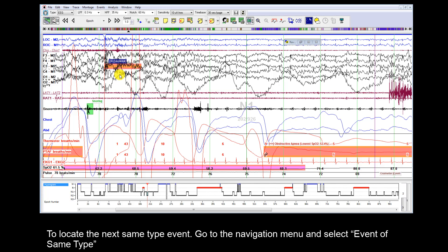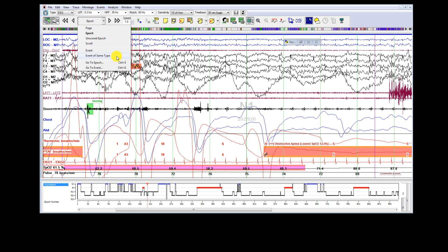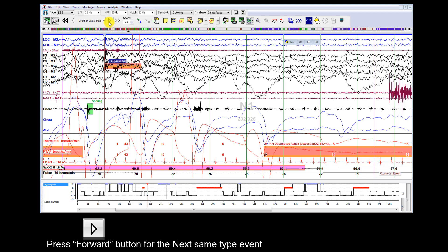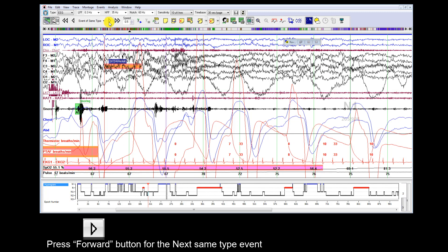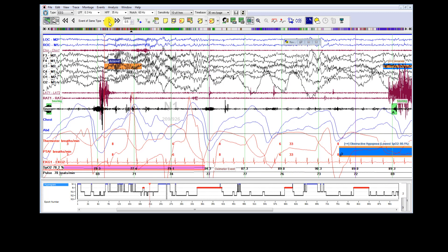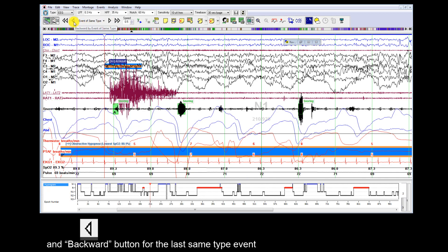To locate the same type of event, go to the Navigation menu and select Event of Same Type. Press the forward button for the next same type event, and the backward button for the last same type event.